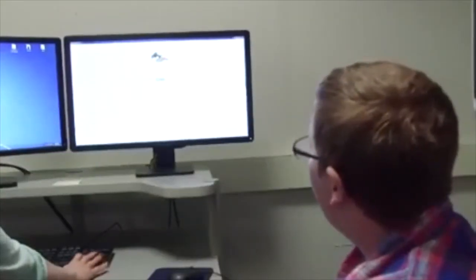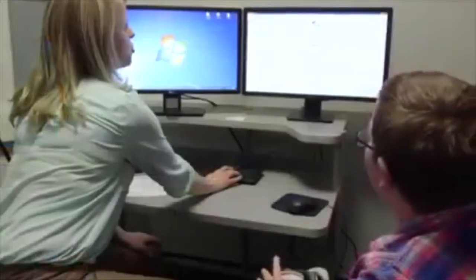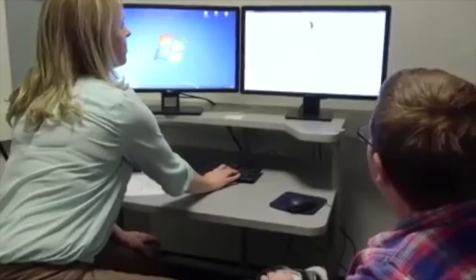Finally, allow the participant to practice throughout the session without the ultrasound and offer the opportunity to successfully practice R without visual feedback.